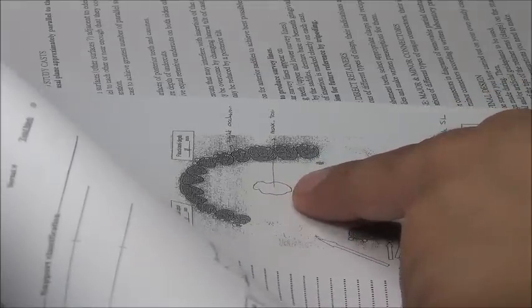Tori. What do we do with tori? This is a case. Anterior posterior bar. Palatal strap. Strap means in the middle. Palatal strap is in the middle. Anterior posterior palatal strap. Okay. Or anterior posterior palatal bar. But what is the contraindication of a posterior component of the palatal? Extension of the tori. If the tori is larger than the vibrating line posteriorly, I cannot. So I'm left with the horseshoe design.